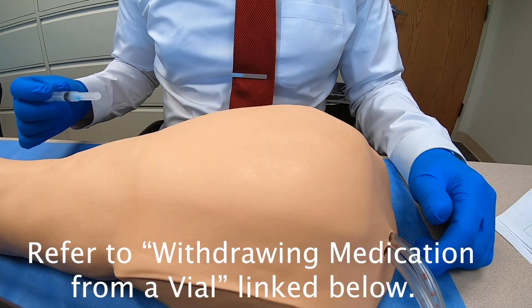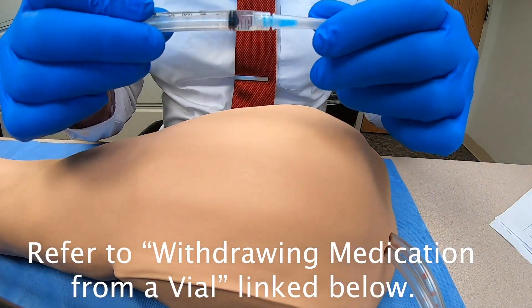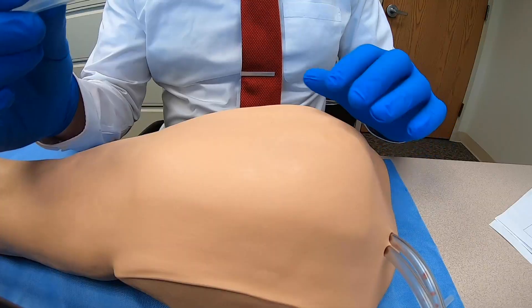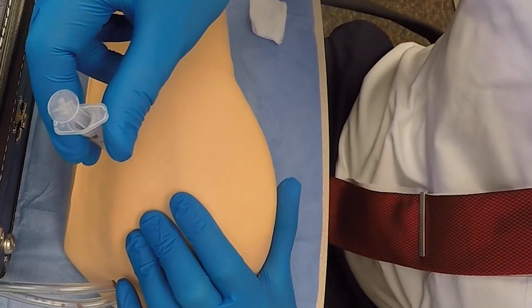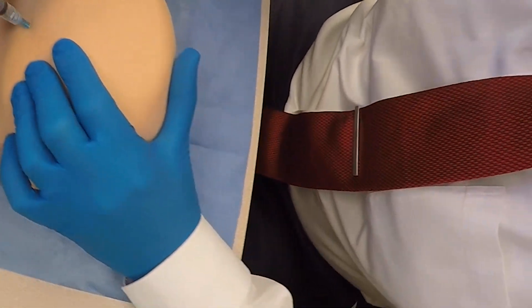For a subcutaneous injection, remove the cap from the end of the needle. Pull the skin taut with the non-dominant hand and insert the needle at a 45 to 90 degree angle.